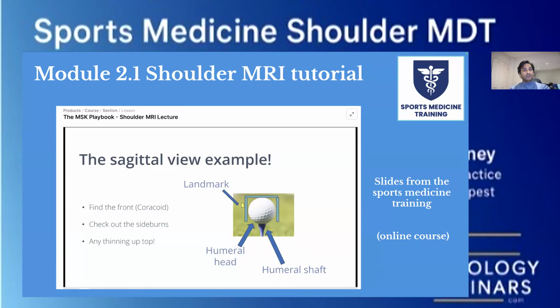It can be very good for looking for contusions, which are kind of like bone bruises, and bone bruises can be really quite bad. X-rays have got a lot of overlap between the different anatomy. So with an MRI scan, you'd be able to identify where the problem could be because of the edema. And also the T1 signal images are very good for looking for the actual fracture line.